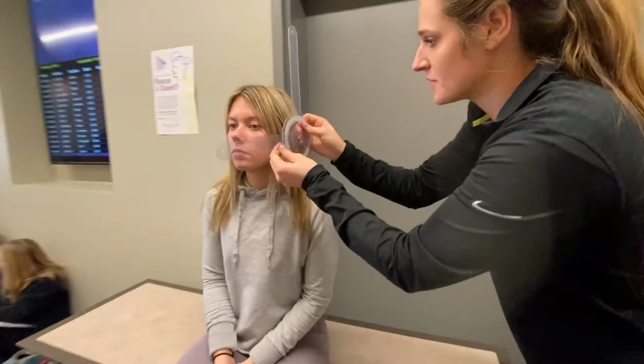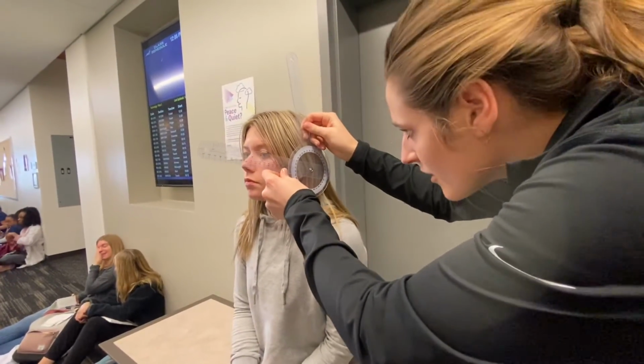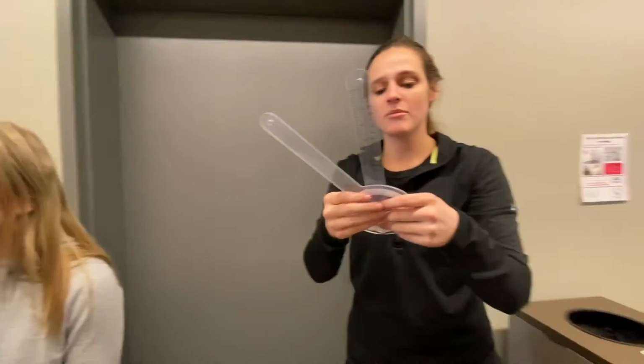So, right here, when you're ready, go ahead and extend your head back. Good job. Report 55. Normal range of motion is 60 degrees. This occurs in the sagittal plane, and the target muscle is the spinalis cervicis.